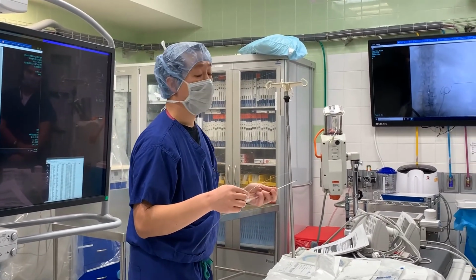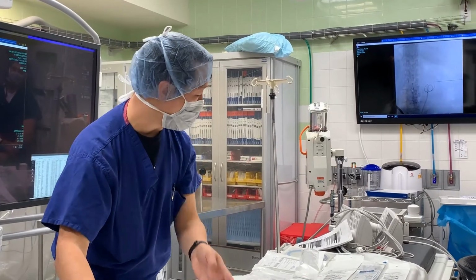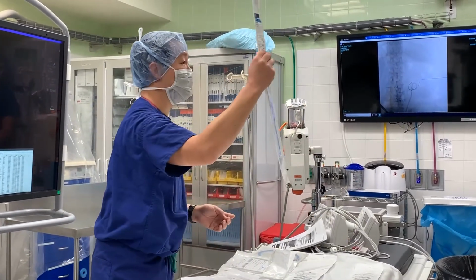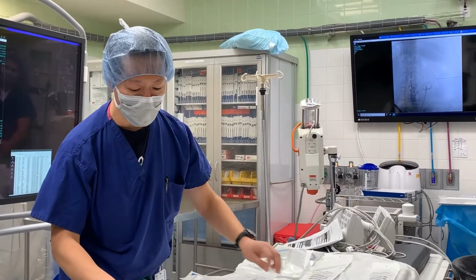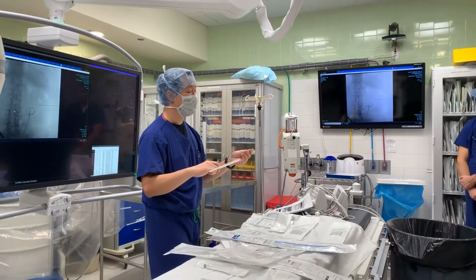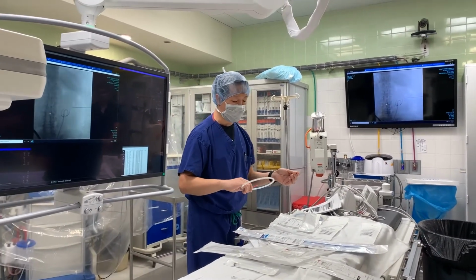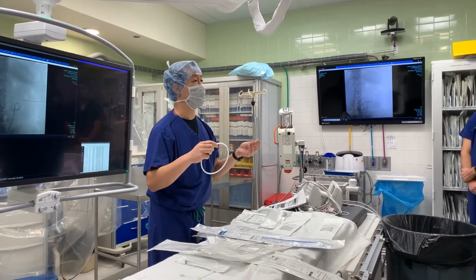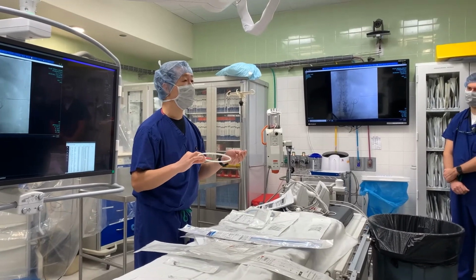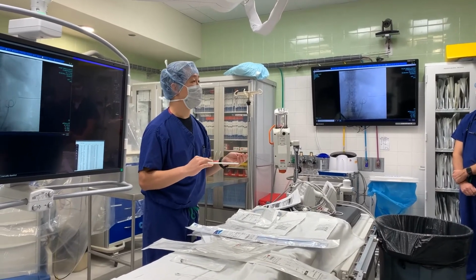What does that mean? It means it's not a rail. Yeah, that's right. I won't be able to push this guy over it. You can if you're lucky, but that's just a dumb thing to do, okay? So you want a working wire that's stiff, okay? So the different wires that we can use are this free wire. I don't even know what this is. This is like a pseudo-Benson, pseudo-Rosen thing.